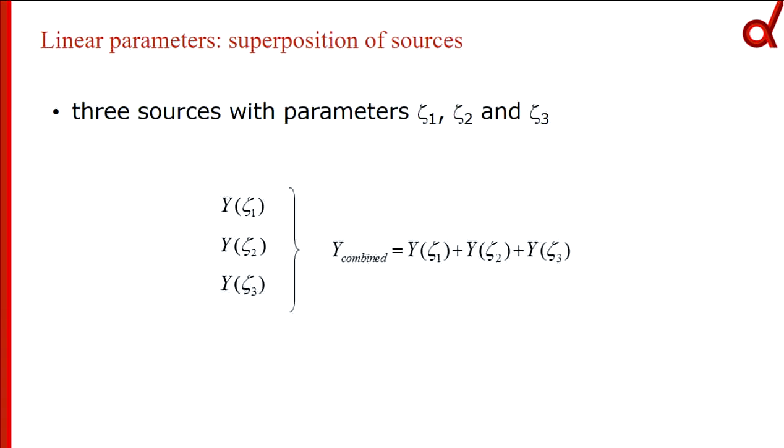Okay, the good thing about sources is that these signals are linear. So if you have several active areas in the brain, we can just sum them up. It also allows us to disentangle dipoles, because they're linear, so it's easy to distinguish them.